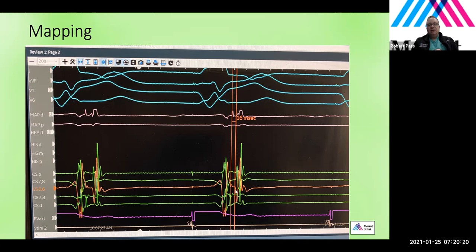That means that the retrograde conduction is purely up the pathway, meaning any retrograde A you can feel confident is not a combination of conduction through the pathway as well as through the AV node. Does that make sense? If you pace the ventricle, you theoretically could be going up the pathway, but also up the AV node, and you may be seeing some fused conduction between the two. Right. But in this case, we elected to do it in V-paced rhythm.